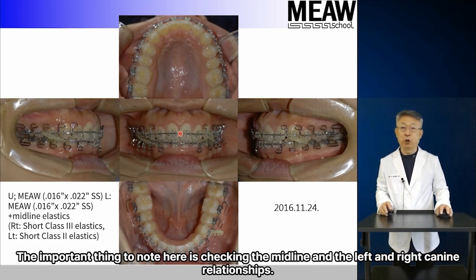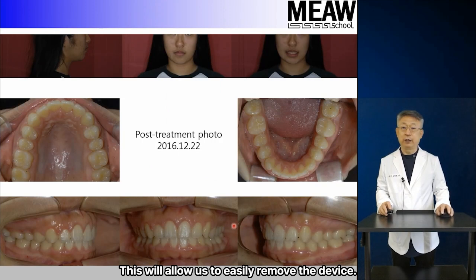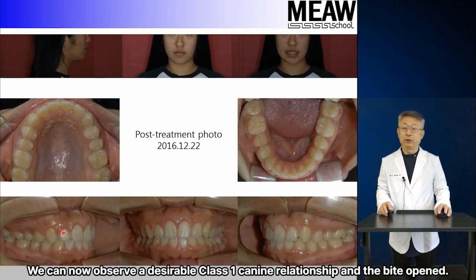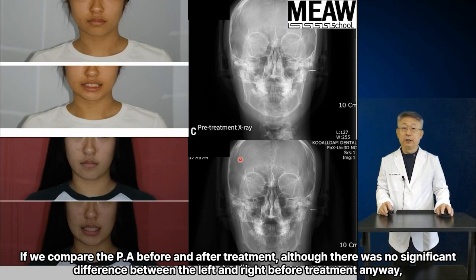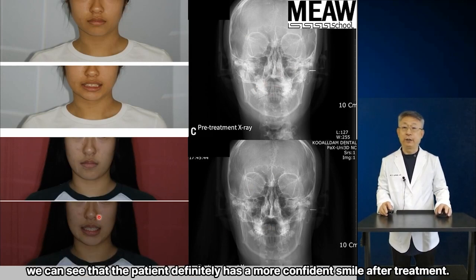The important thing to note here is checking the midline and the left and right canine relationships. This will allow us to easily remove the device. We can now observe a desirable class 1 canine relationship and the bite opened. If we compare the panorama before and after treatment, we can see that the mesially angulated mandibular molars have been uprighted. If we compare the PA before and after treatment, although there was no significant difference between the left and right before treatment anyway, we can see that the patient definitely has a more confident smile after treatment.